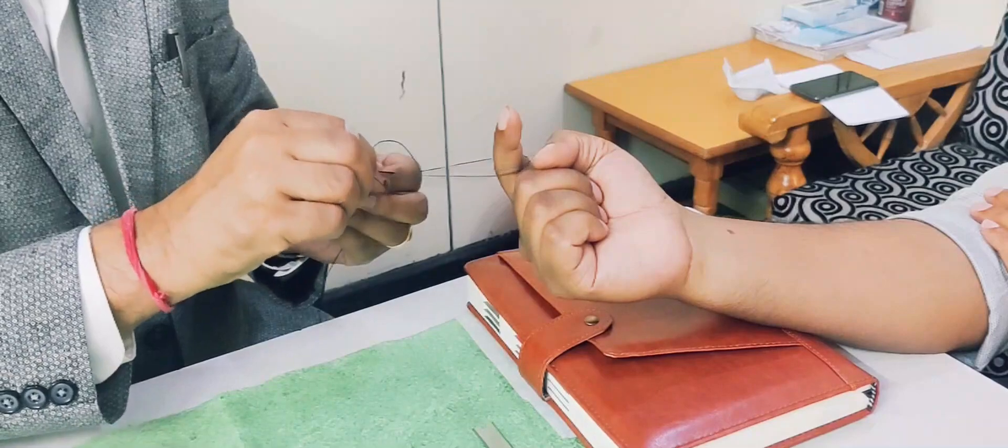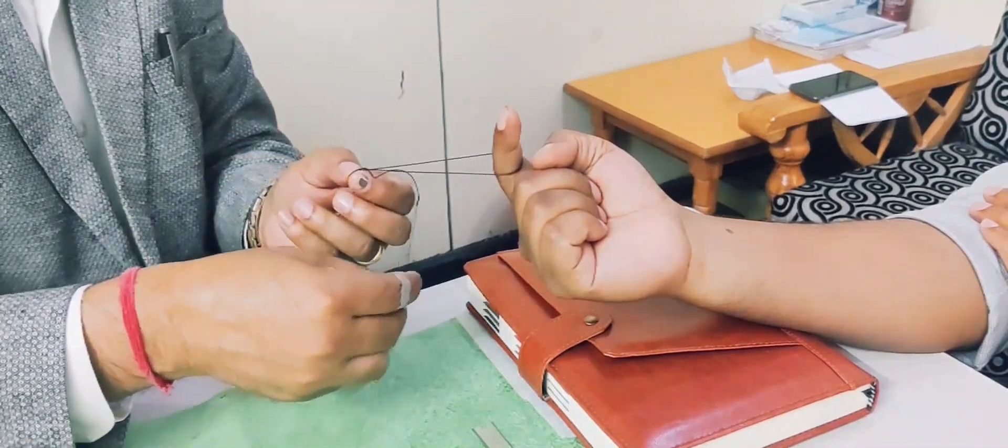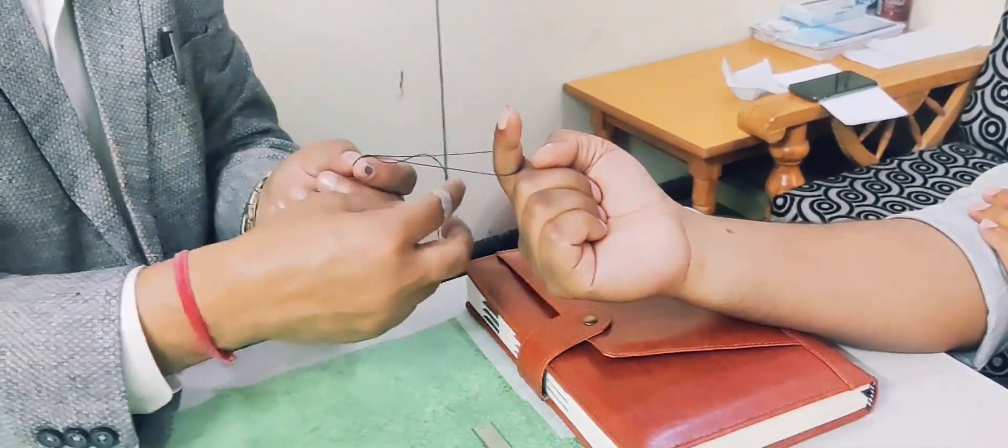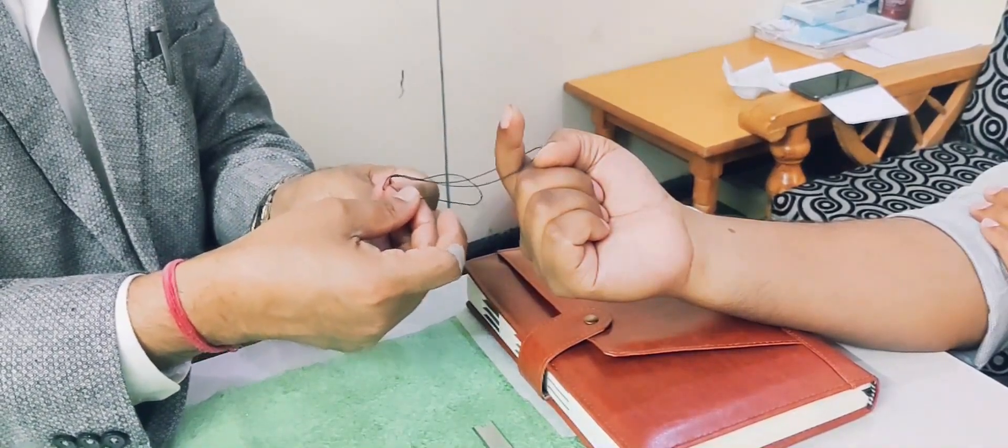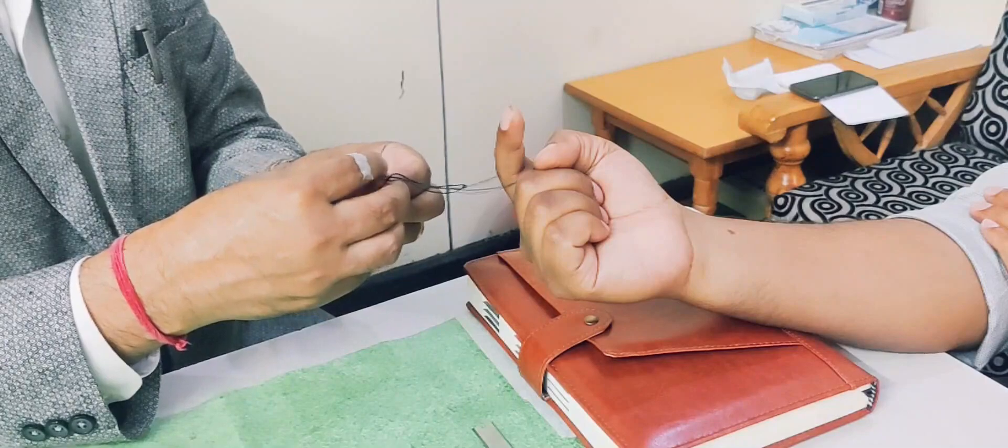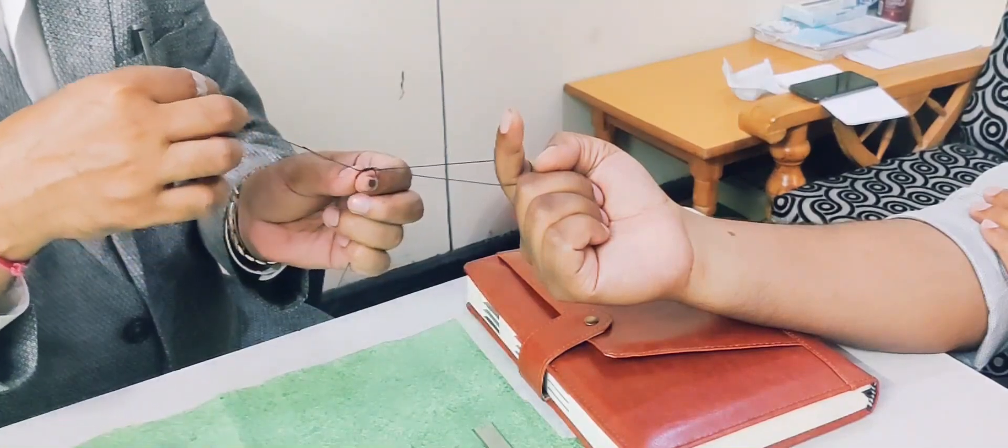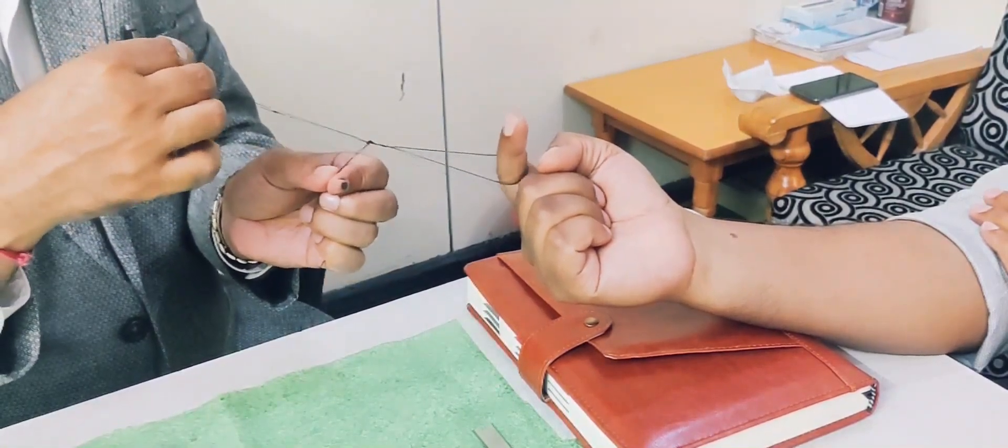And after that, you have to go from down side up into this loop. Now here your knot is ready.